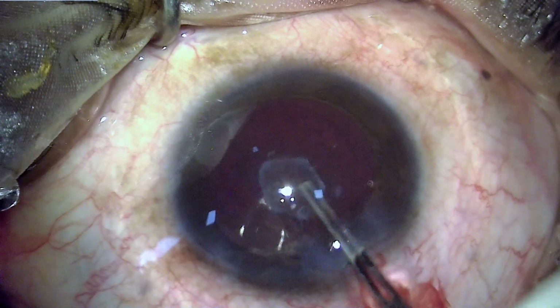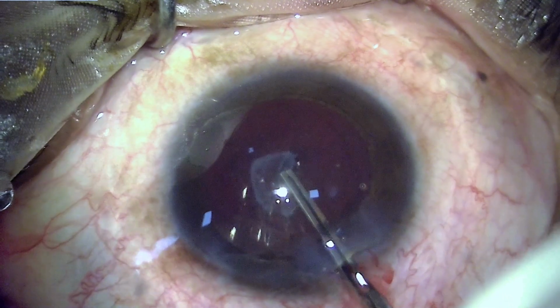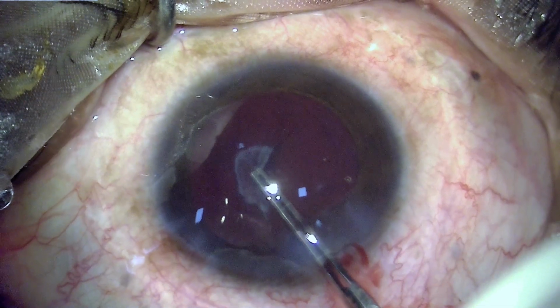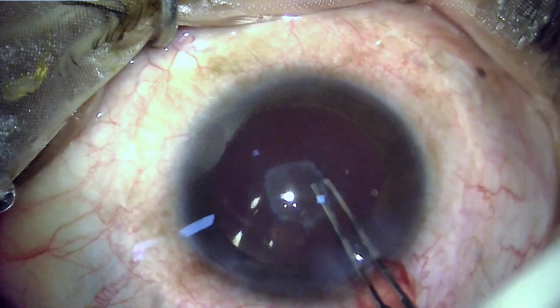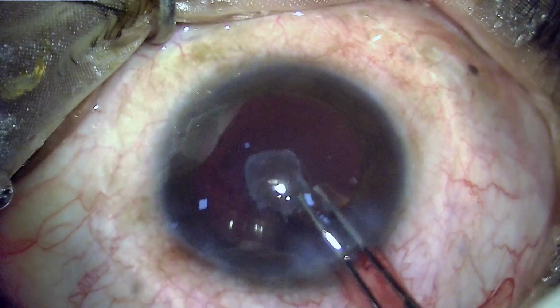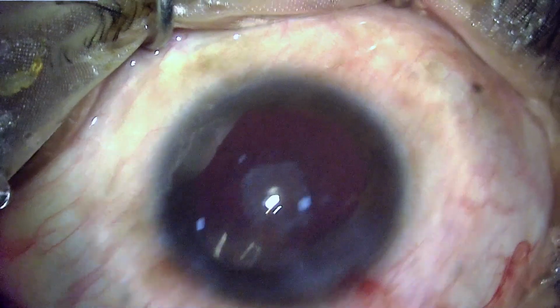But at this moment, when holding and trying to peel it, I realized that this plaque is too tightly adhered to the posterior capsule, and any attempt to remove this plaque may cause damage to the posterior capsule, which is something I want to avoid at any cost.